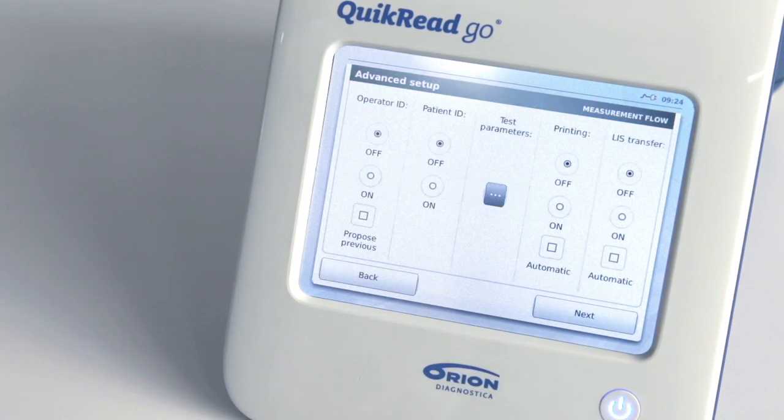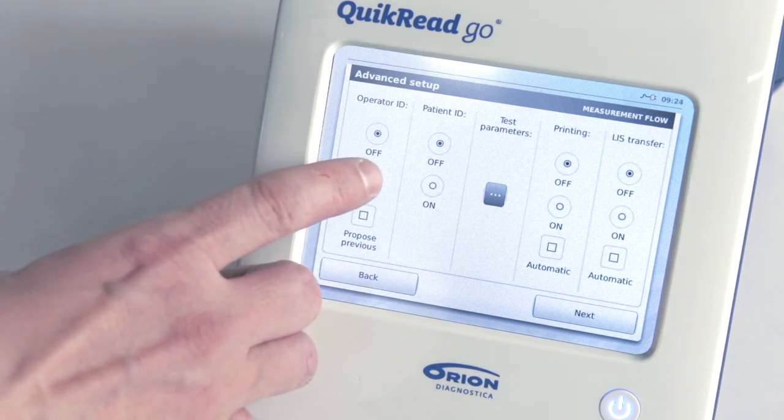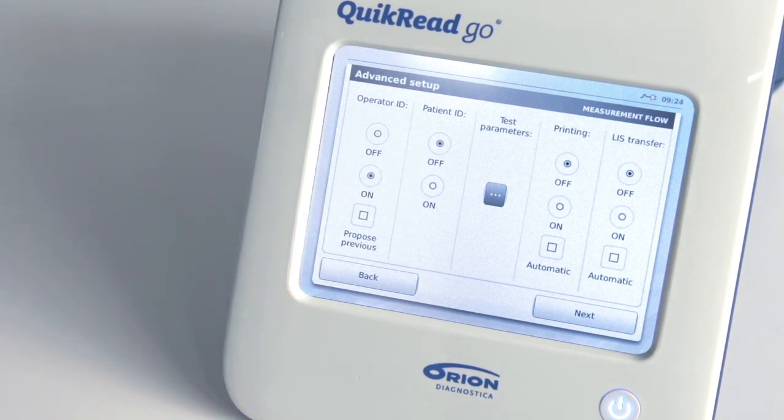You will enter the measurement flow screen which allows selecting patient ID, operator ID, and print or LIS transfer to be set on or off. Select operator ID on if you wish to use an operator ID connected with each measurement. If you select Operator ID on plus Propose Previous, the instrument uses the same operator ID until it is changed.